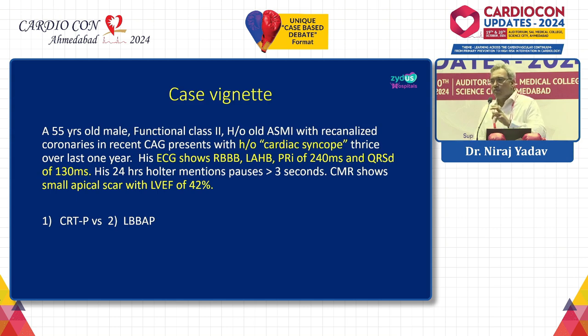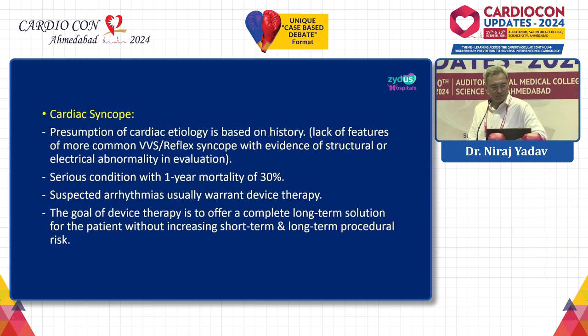24-hour Holter mentioning pauses more than 3 seconds, I would consider it as a very non-specific thing, because pauses in themselves do not mean anything. You have to see whether these pauses are related to patient symptoms, what time these pauses have happened, whether the patient was asleep during these documented pauses, and what is the character of the pause, whether it is related to AV block or sinus pause, whether these AV block related pauses were accompanied by sinus rate slowing. These are very important information before we make a decision on the basis of pauses.